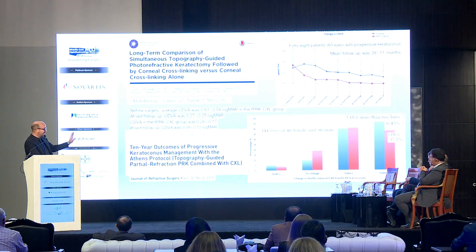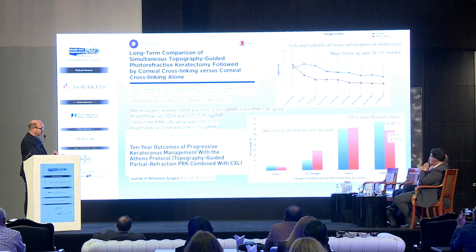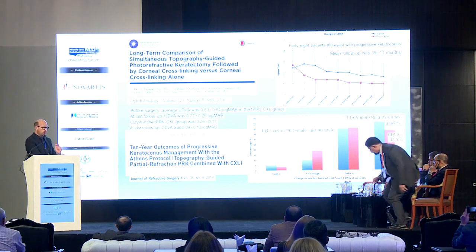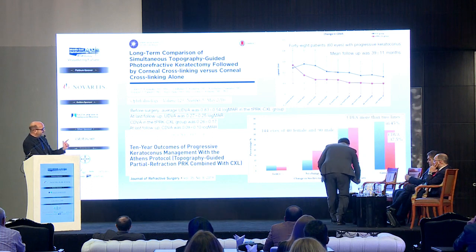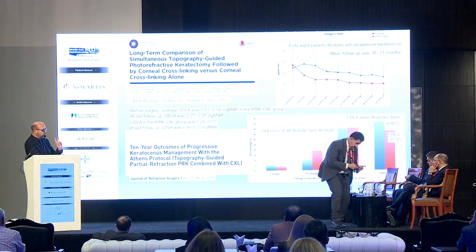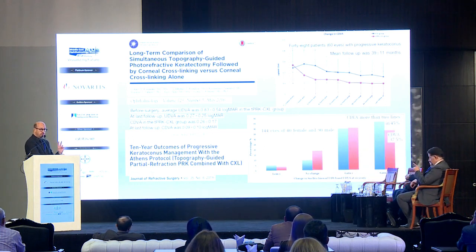Take a look at long-term results. These are the 10-year outcomes. The 10-year outcomes showed no adverse events, no complications, a gain in corrected distance visual acuity of more than 2 lines, and uncorrected visual acuity in 45%.